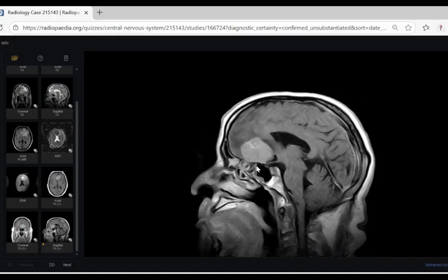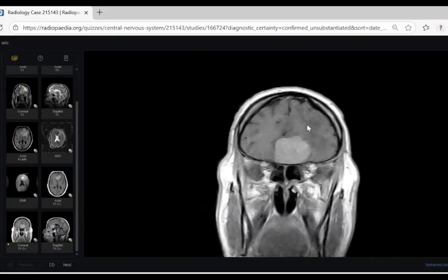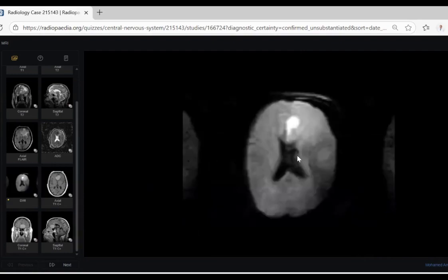Tell him collectively, but the most important thing is to pick up the disasters. By the way, they may bring a case like this to make you consume time on many side findings, and you lose something important, and it will be very easy for him not to pass you. So don't involve yourself in too many fine details away from the pathway of the case.